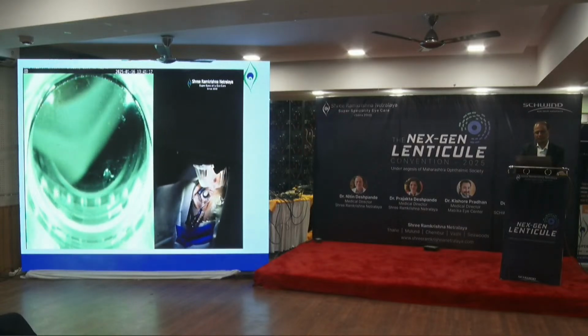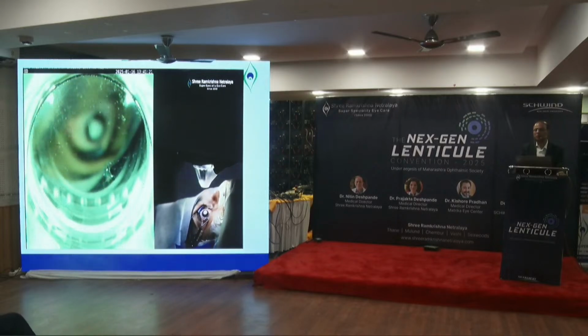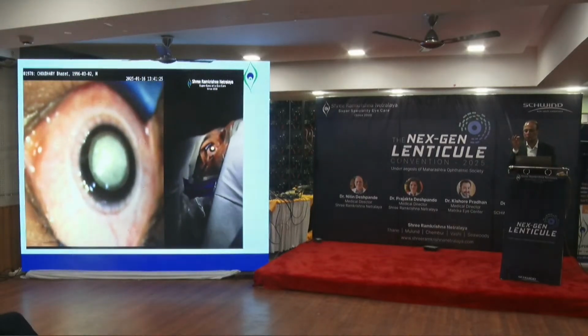Now I will quickly remove the lenticle. Patient might be scared at this point because he's not seeing things. Fine, you have to tell him that everything is okay. And now you move the bed little up, and you see through the microscope.